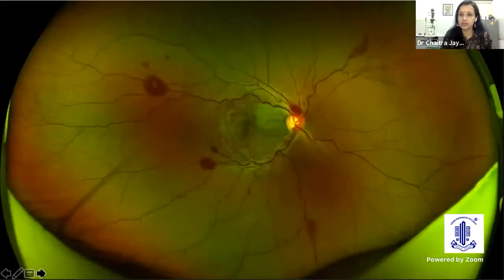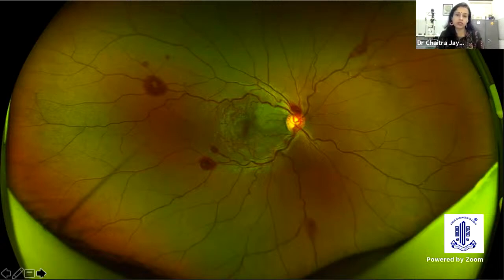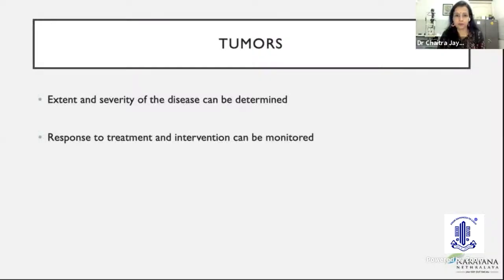This is a young intern, an MBBS student, who came in like this. She's just 23 years old, came in with this presentation, turned out to have a protein S or a protein C deficiency, and now she's on treatment. Luckily, the other eye is fine. And if you notice here, I don't know if you can see my cursor, there was also a small arteriolar occlusion, which gave a scotoma. Now she's definitely getting better with treatment.